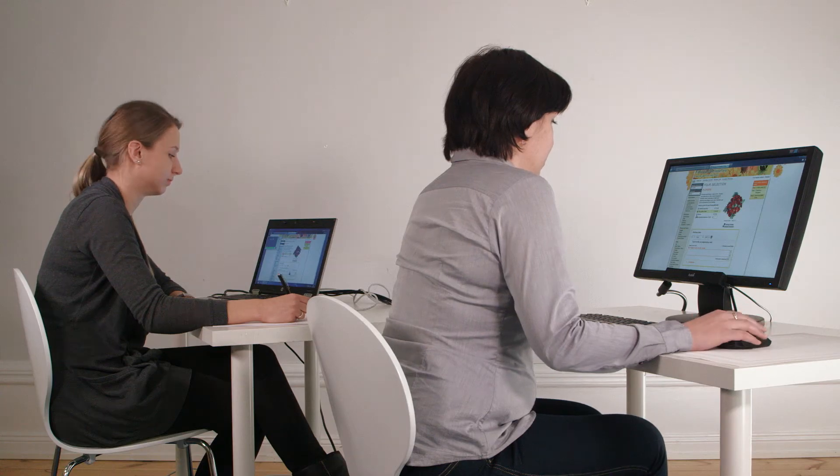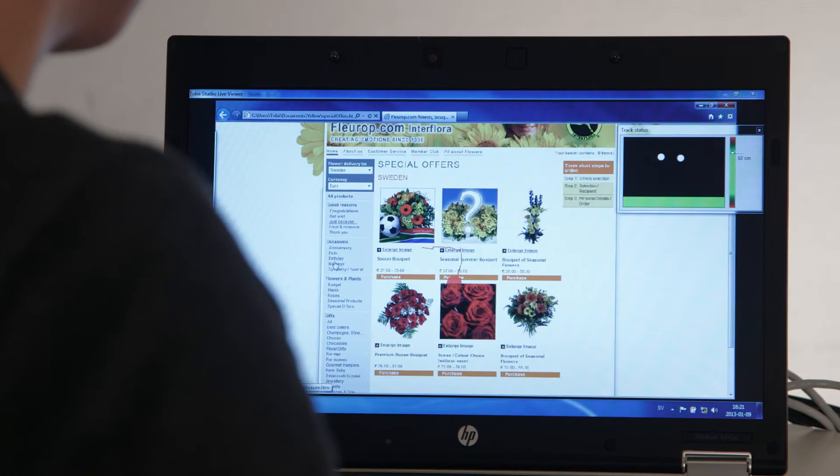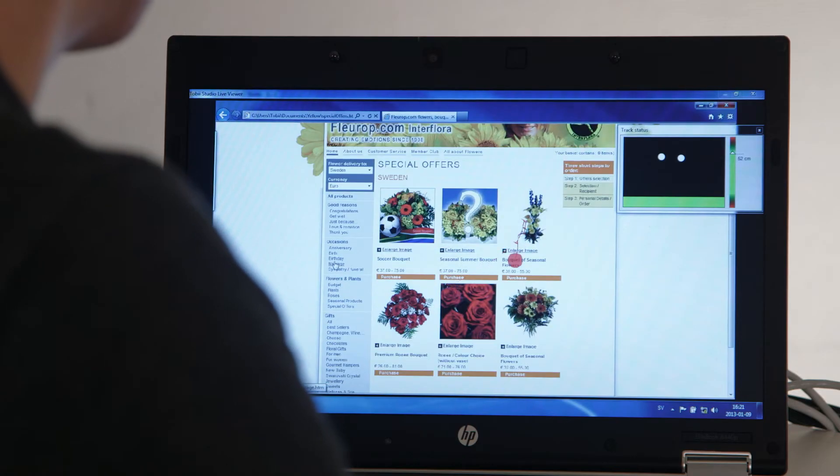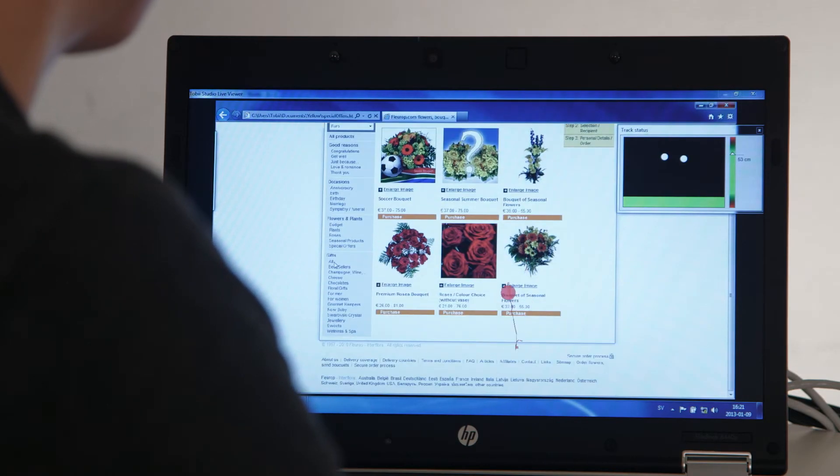This video will guide you through the setup and installation of the Tobii X2 eye tracker.